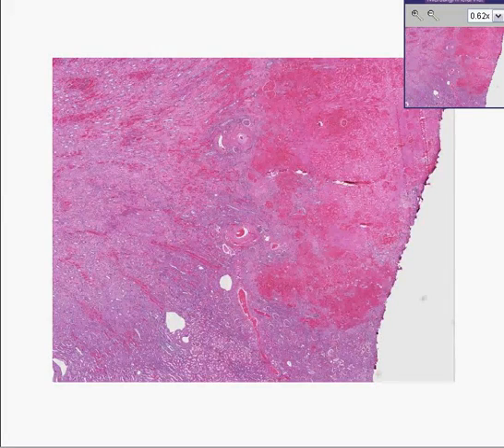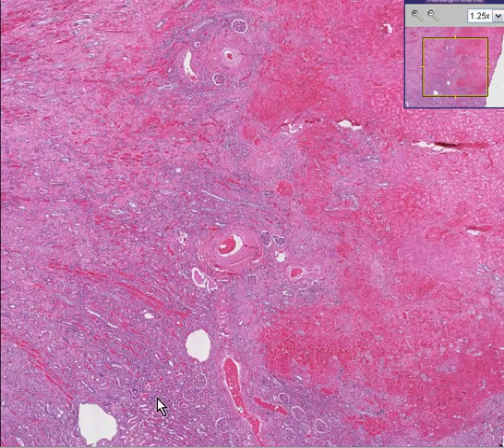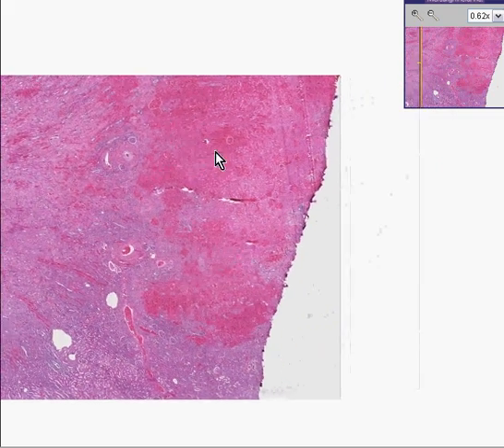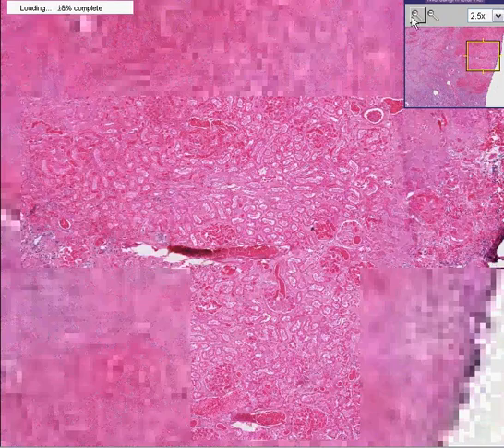Here is another case, and I think we could recognize this once again very quickly as being a kidney. You can see glomeruli here, all throughout here, all throughout here. You can see a lot of tubules here. But in addition, you could see a very distinct and fairly wedge-shaped area of hemorrhage and necrosis out at the more outer cortex. This is very, very classical for an infarct.